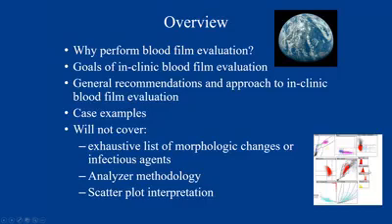So this is an example of a scatter plot that our analyzer spits out at the university that we utilize. But again, if you're interested in that, tell Francesco and he can hopefully organize some more talks related to that because it is an entire science in and of itself.